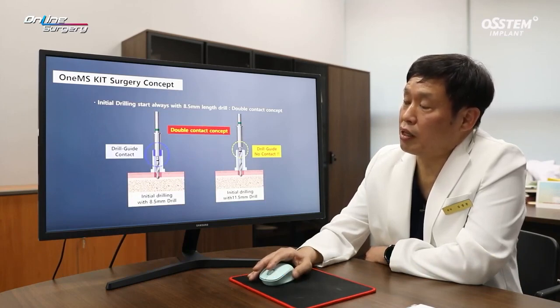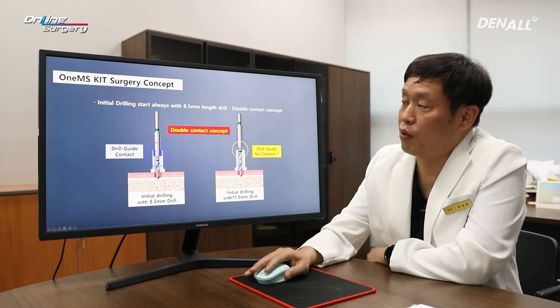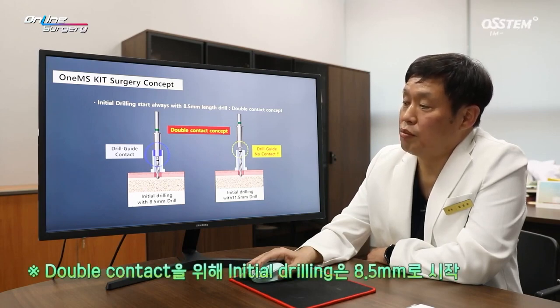In one guide, the double contact concept is very important. When double contact is made, the deviations or slipping of the drill can be avoided in large part. The initial drill needs to be 8.5 mm. I'm going to place a 10 mm implant. However, if you just go straight to 10 mm, the drill guide may not be in full contact and it can slip. Therefore, you need to use 8.5 mm drill first and gradually increase to 10 mm or 12.5 mm. I want to emphasize this once again.